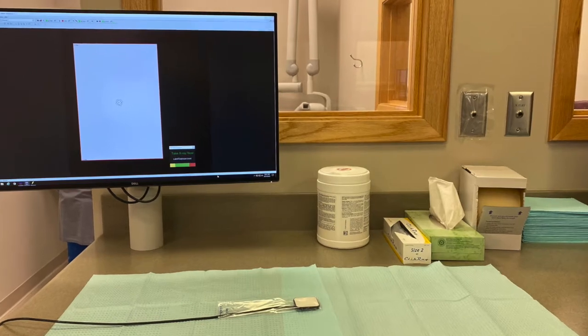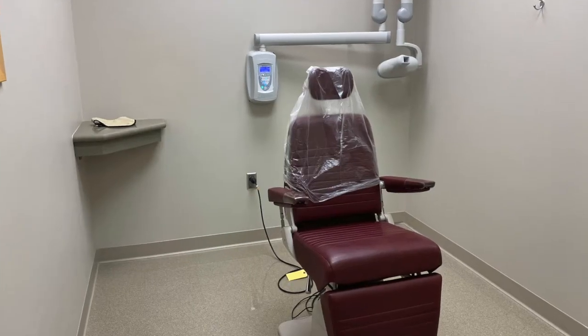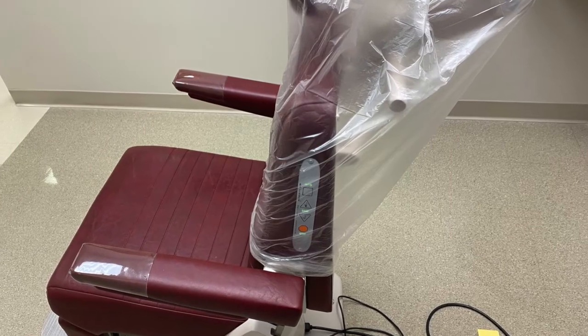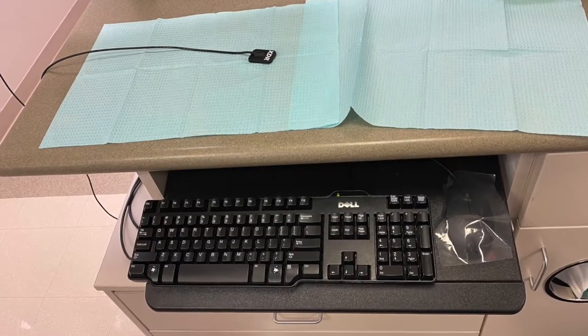Prior to seating the patient, the operator should wash hands, don clean gloves, place plastic cover over sensor, place protective barriers as shown, a plastic bag over the patient chair, set up equipment, instruments, and everything else on top of two bibs.